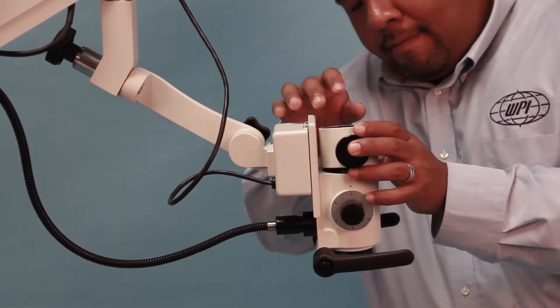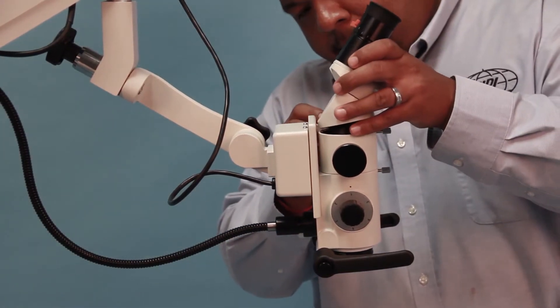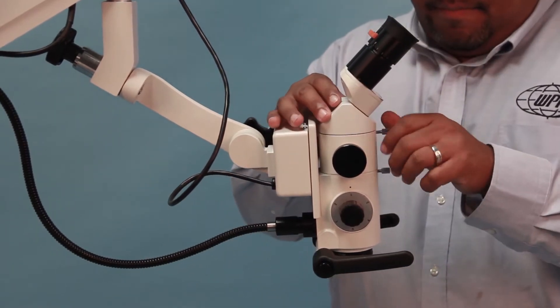Place the beam splitter in the aperture and tighten the set screw. Place the binocular headpiece into the beam splitter and tighten the set screw on the beam splitter.